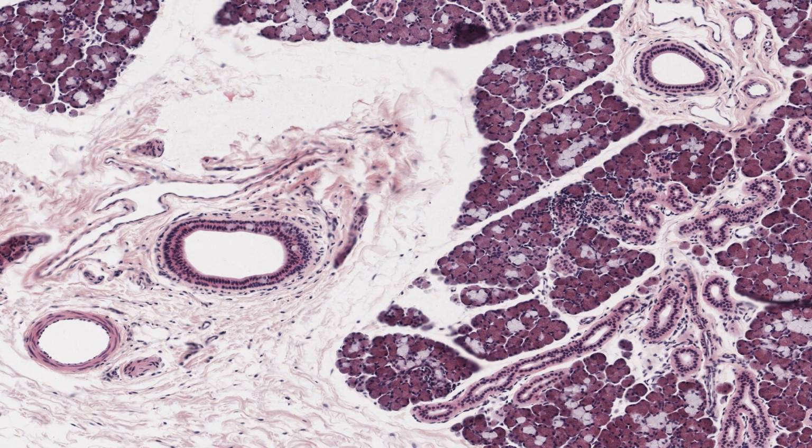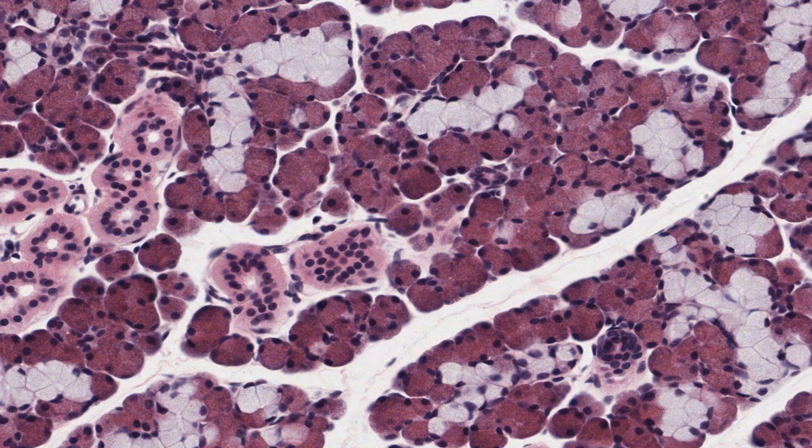Interlobular ducts are very nicely preserved here, and you can see some cases of the elusive stratified columnar epithelium and stratified cuboidal epithelium. And as I mentioned earlier, the submandibular or submaxillary gland is tubulo-alveolar in form. This is why the secretory units look a bit messy.